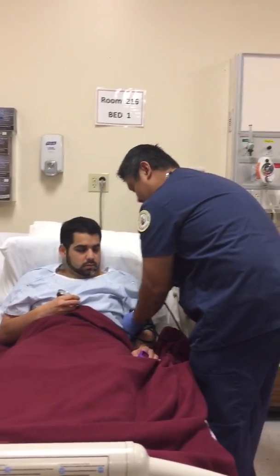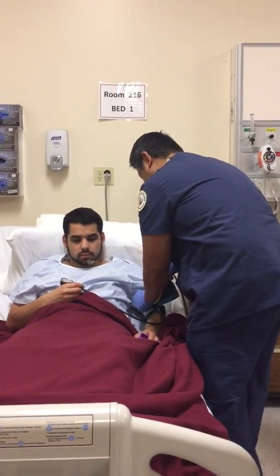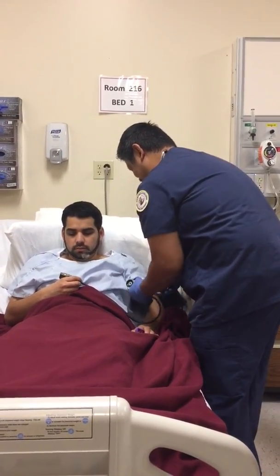Thank you, Christian. I got 120 over 70. Is that about normal for you? Thank you, Christian.